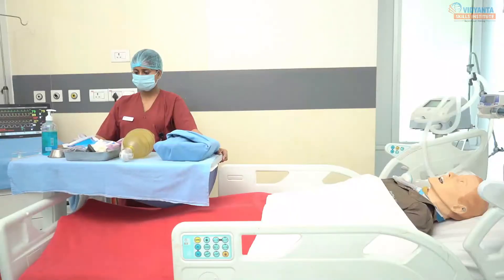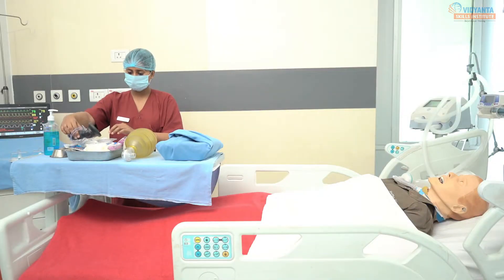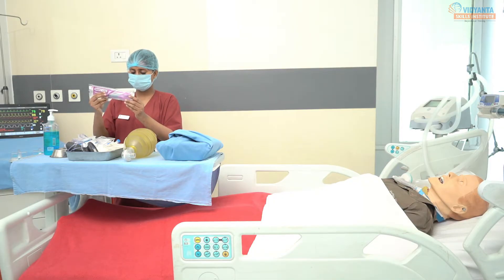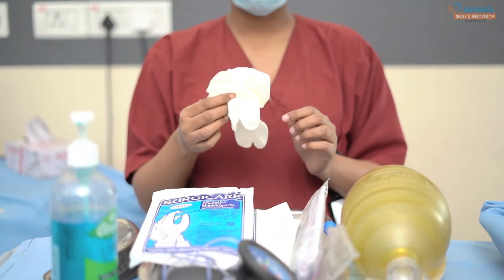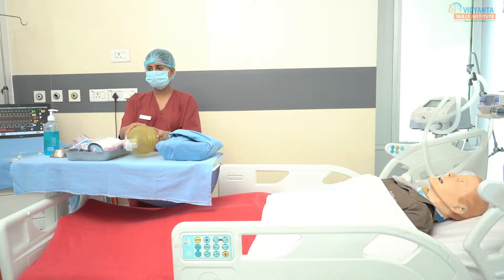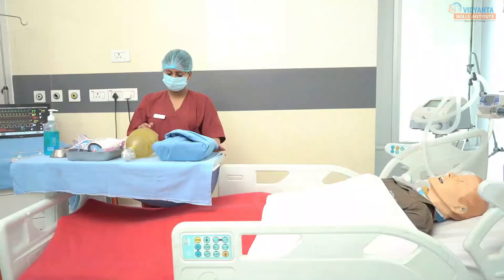Arrange the articles. Equipment required: a clean tray containing a trach collar with keyhole foam dressing, cuff pressure manometer, normal saline solution, 20 or 50 ml syringe with 18 or 16 gauge needle, one pair of sterile gloves, one pair of clean gloves, sterile gauze piece packet, bag mask. A sterile tray containing: drape sheet, artery forceps, thumb forceps, bowl, and kidney tray.